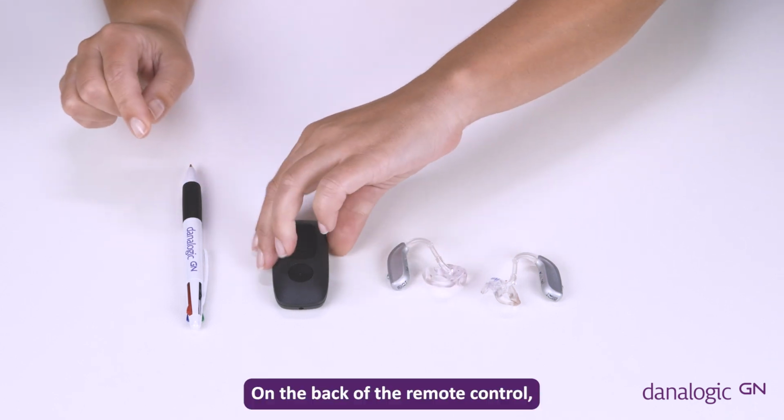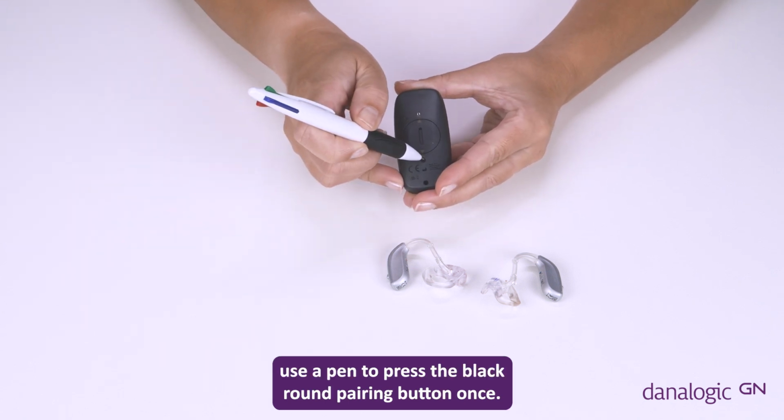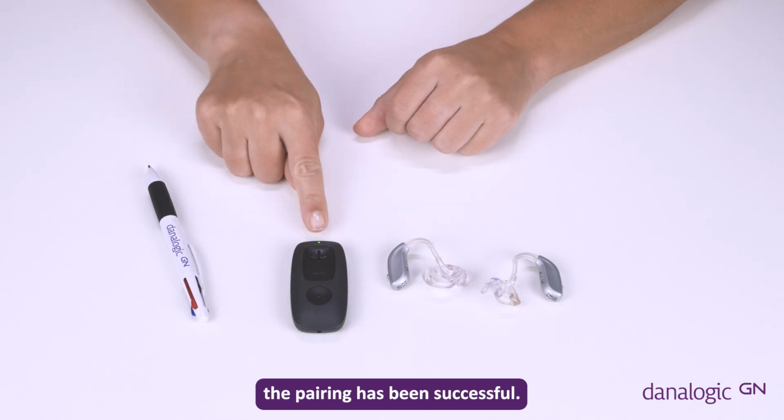On the back of the remote control, use a pen to press the black round pairing button once. A green steady light will confirm the pairing has been successful.